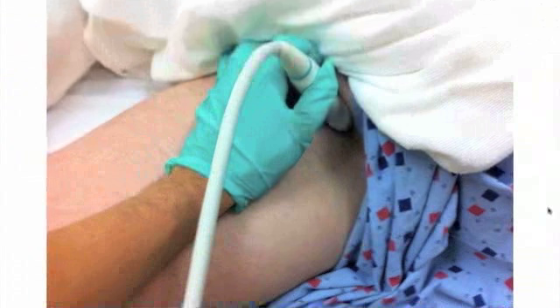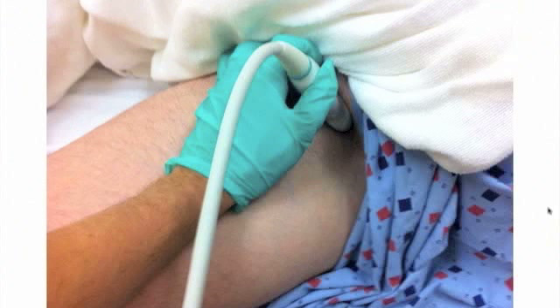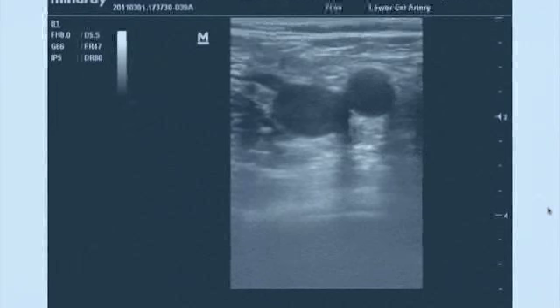But as you can see, this is uncomfortably high. You've got to go pretty high up on the femoral vein to find where the saphenous comes out. You got to get up in their junk. Yeah, you got to be brave. You got to go on up in there. This is what it looks like. You've got your artery there. You've got the femoral vein, and then you've got the saphenous coming off. This is the spot you want to be.